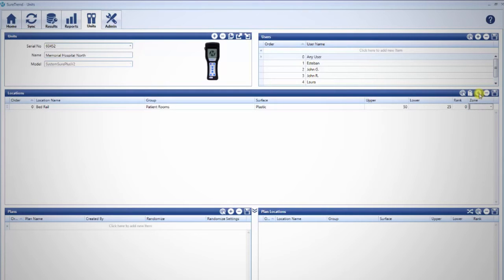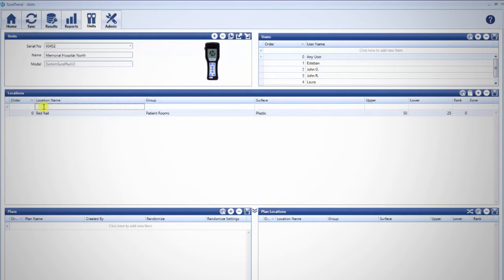Hygiena luminometers display up to 20 characters for the location name. You may also click into the empty box under Location Name and start typing.